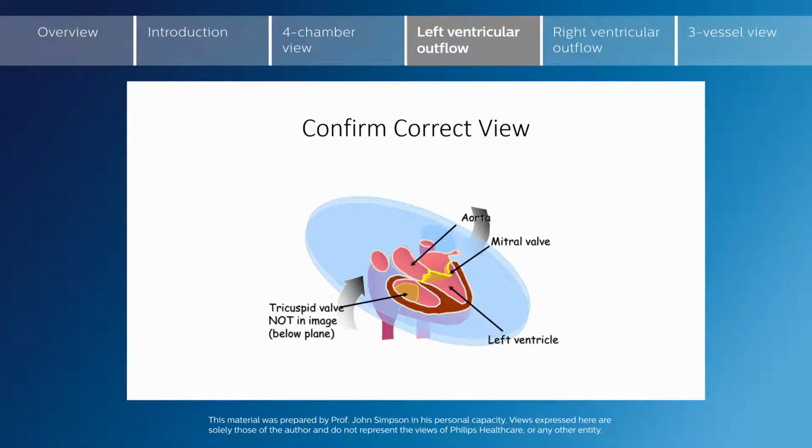And what we would like to see is the left ventricle connecting to the aorta, which heads, as we see here, superiorly and to the right towards his right shoulder. We can also see that we're now beginning to move above the level of the right atrium and starting to cut the superior vena cava in transverse section.